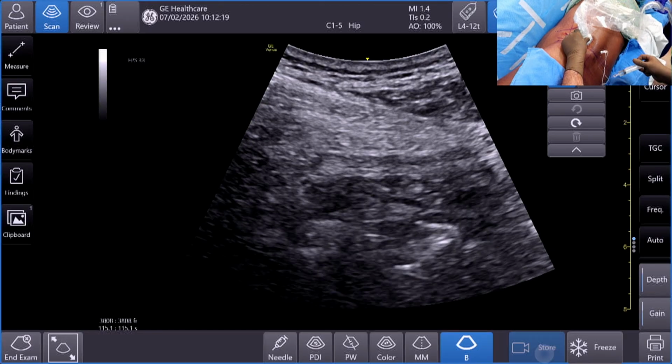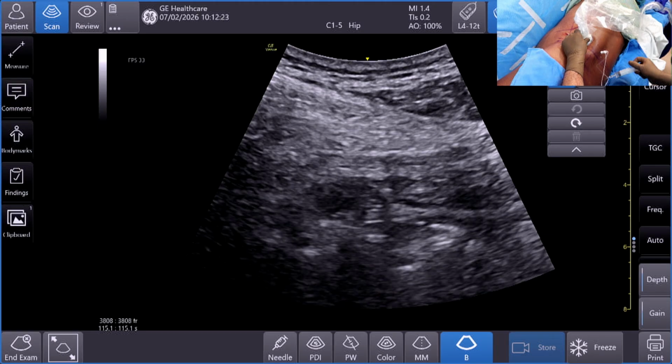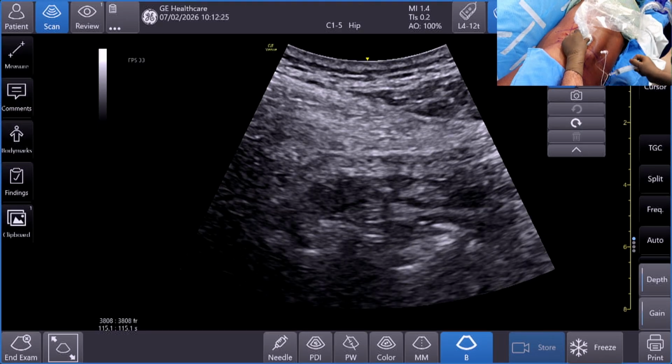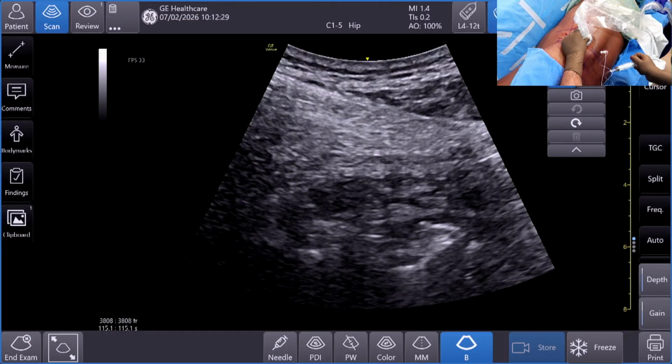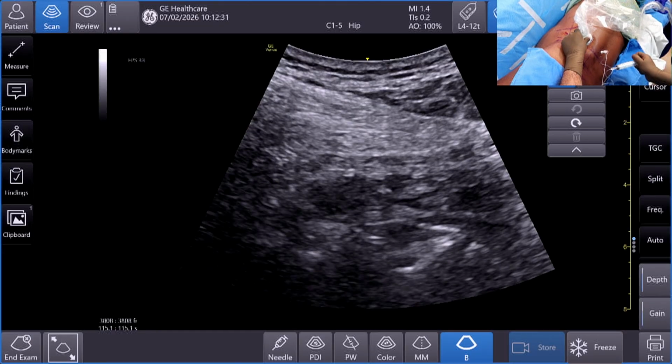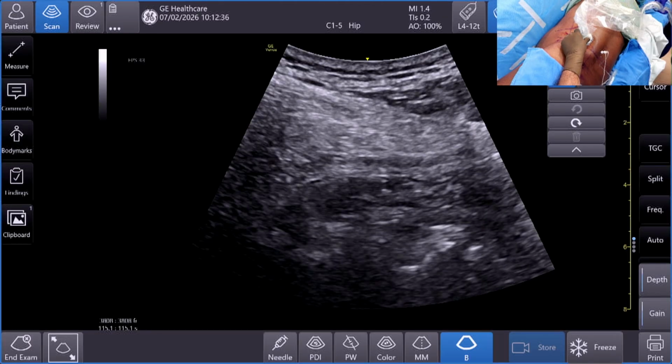So this is happening in the posteromedial quadrant, as we said it is located. Yes, posterior, because what you see on the top, the entire hypoechoic area, is the lumbar plexus along with the local anesthetic and the psoas major above it. And below will be a thin strip, as I said.